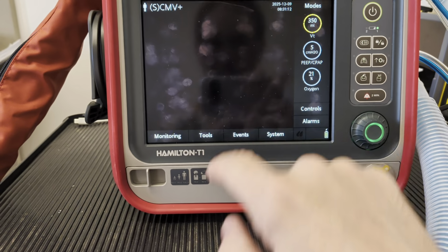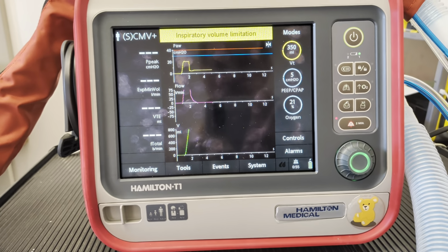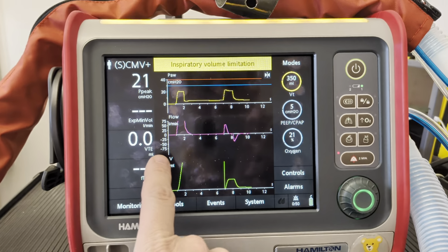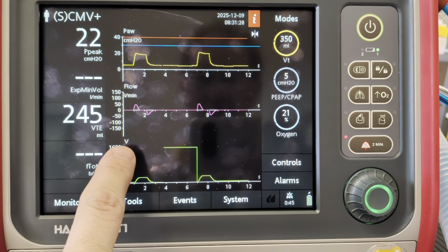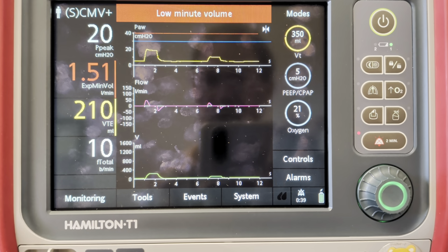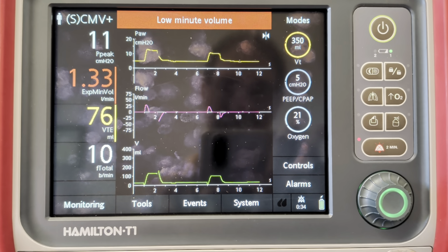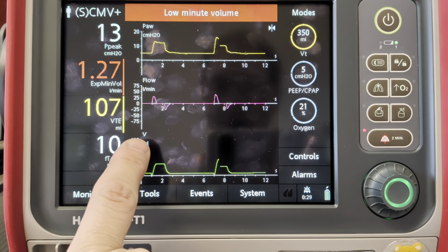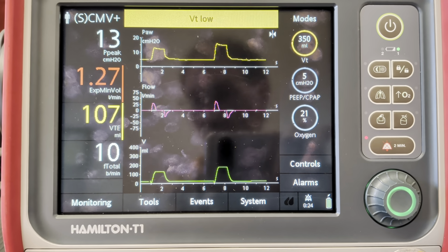So what I'm going to do is initiate mechanical ventilation here. And one of the important pieces of information that you can gather from the ventilator is the flow time scalar waveform. Why is the flow time scalar waveform so important when it comes to identifying obstructive pathology? Well, it's important because airflow obstruction is the primary sequelae that we see in the setting of airflow obstruction.